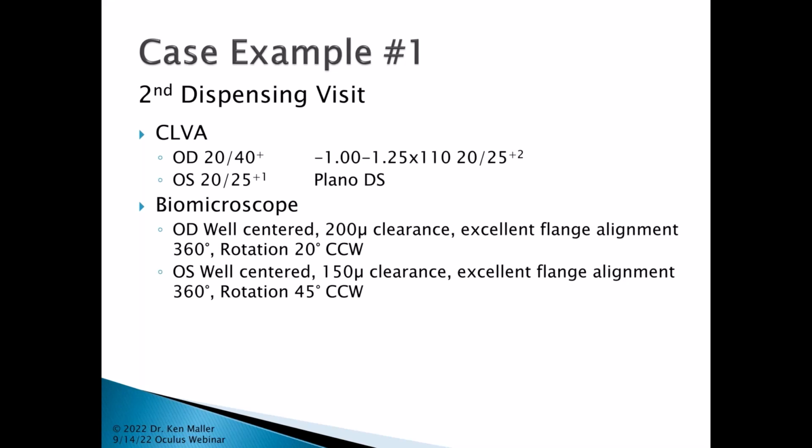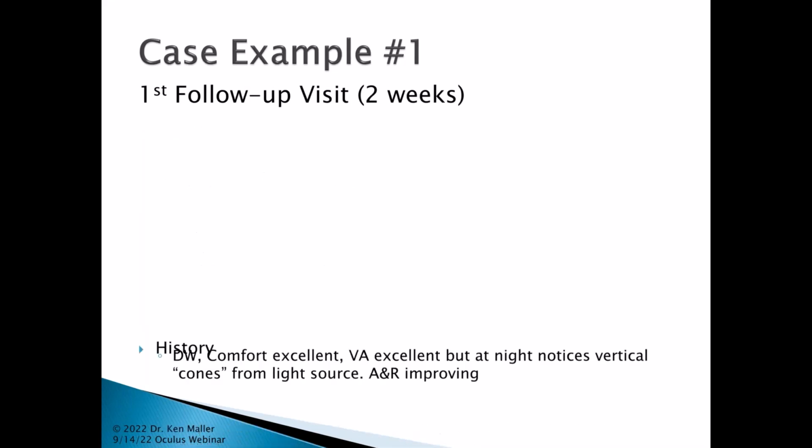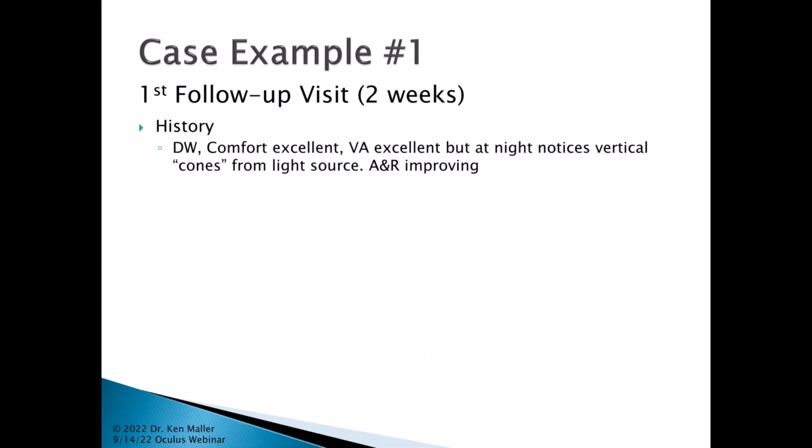That was a considerable amount I wasn't expecting, yet the acuity was fine. So I decided to dispense the lenses and hold on any changes. So she came back a couple of weeks later. She said she's wearing them every day. Comfort's excellent. She's seeing great, but at night she's noticing some vertical cones that are coming from light sources, and she is getting better at application and removal.